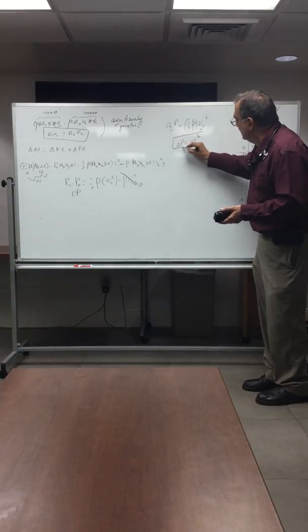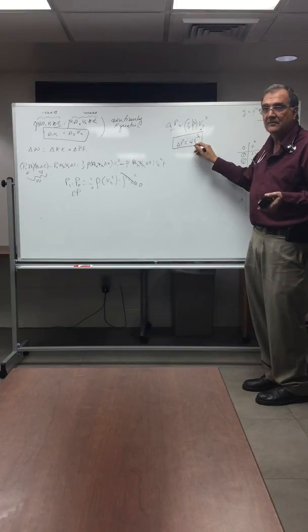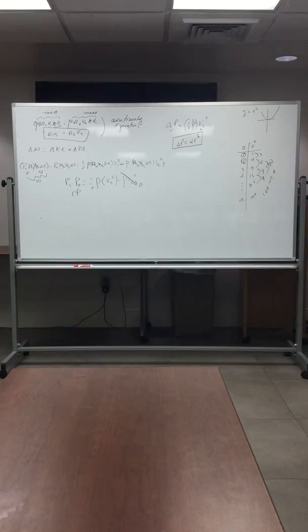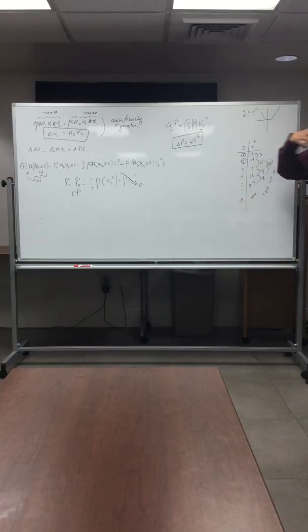And this is what they call the modified Bernoulli equation, which relates velocity across the aortic valve to the change in pressure across the aortic valve. Everybody understood that? Okay. So when we measure velocity across the aortic valve, we go to meters per second.